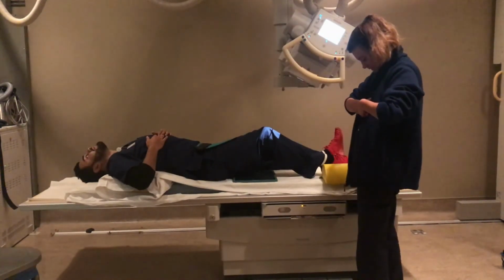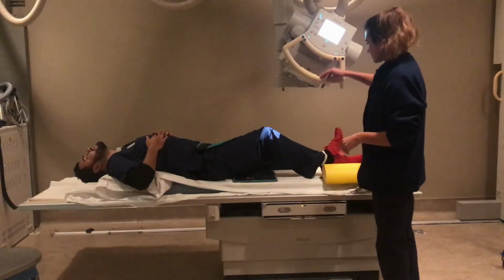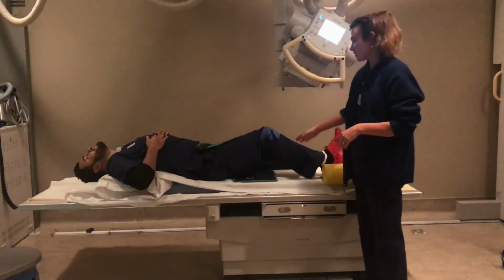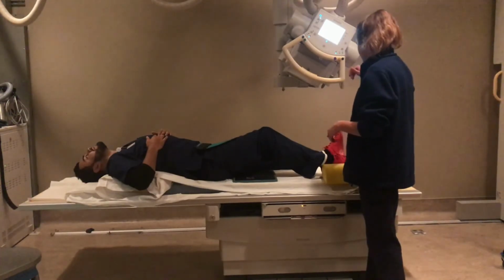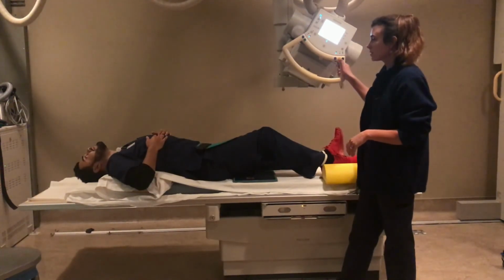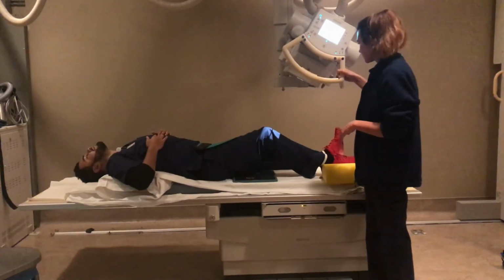Okay, and this is his right knee. So perpendicular to the lower leg, like I said, and it also enters the femoral tibial joint space. 40 inches away.